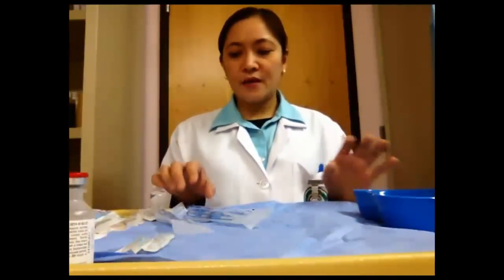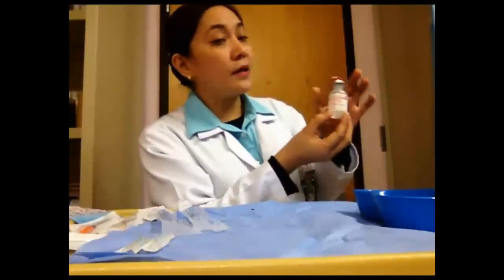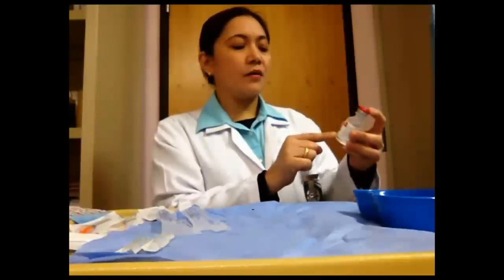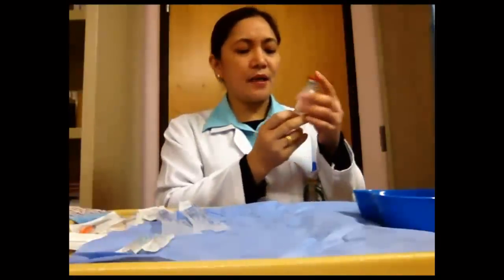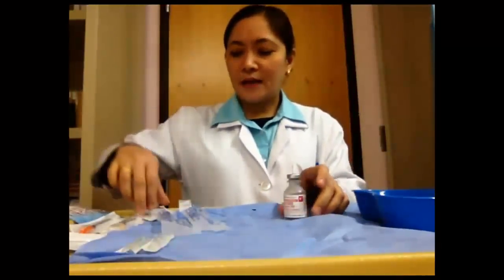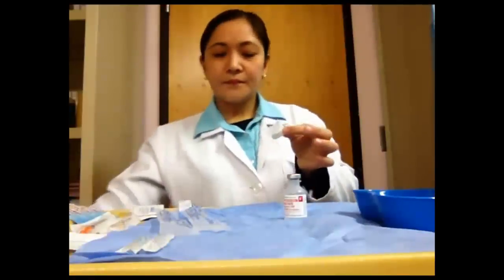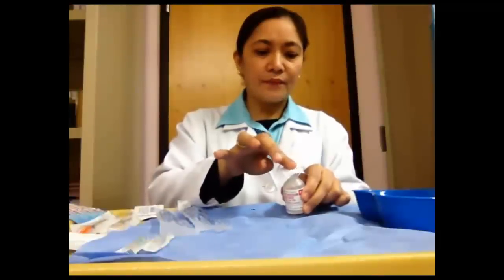Okay, so first we have to open the vial. Before that, you have to read the label of the medication, whether it is the correct doctor's order, and then check for the expiration date and the cloudiness of the medication. Let's remove the cover of the vial, get an alcohol swab, and clean the top of the vial.